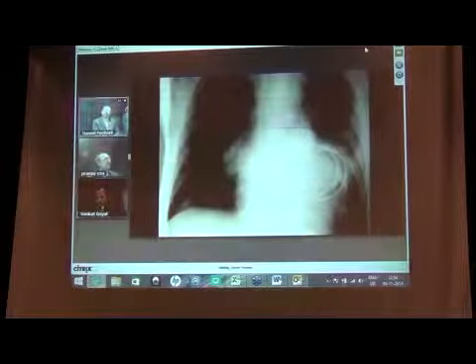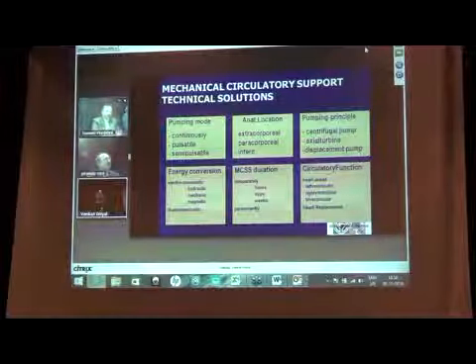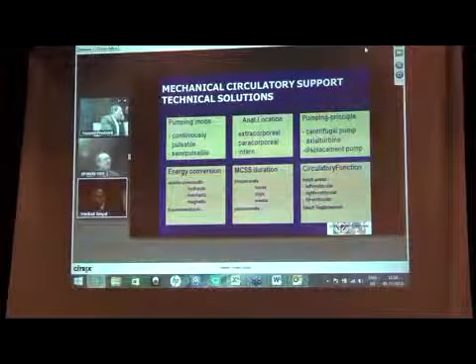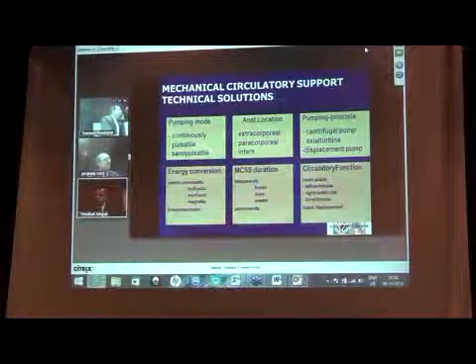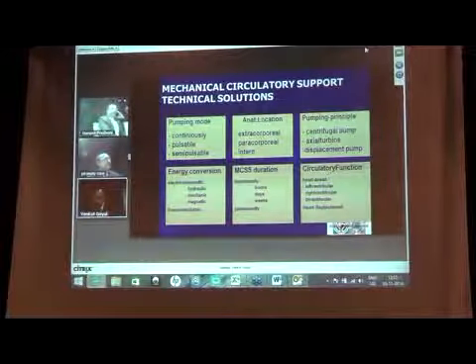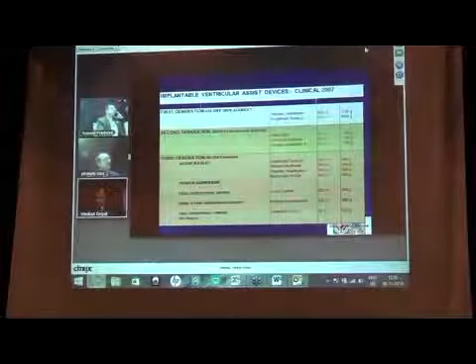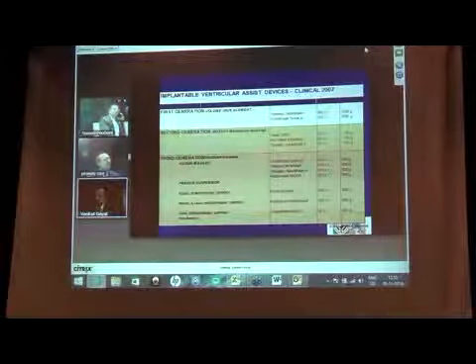There were various shades from extracorporeal to intracorporeal, to pulsatile to axial flow, to pneumatic devices to electrically driven devices, from electrically driven devices to magnetic devices, from rotor flows to axial flows. So there were various eras of transformation in the technology of making the pump engine or the artificial heart, and perfecting it to suit the size of the patient. So these are first generation, second generation, third generation, rotor flows and axial flows, pneumatic ones and electrically driven ones, extrathoracic and intrathoracic, again pediatric group and adult group.